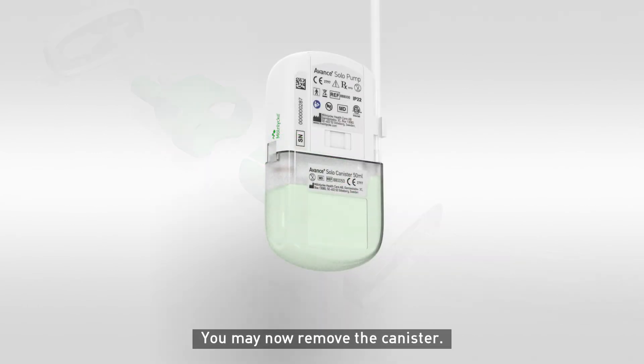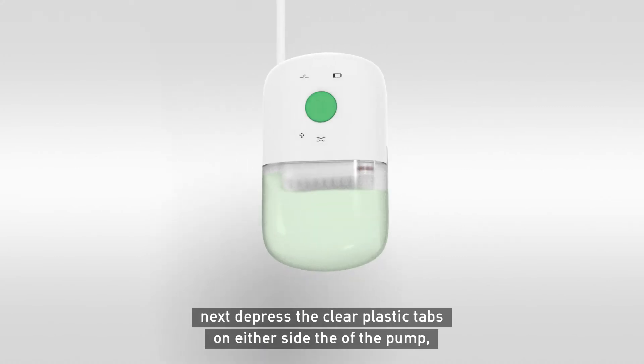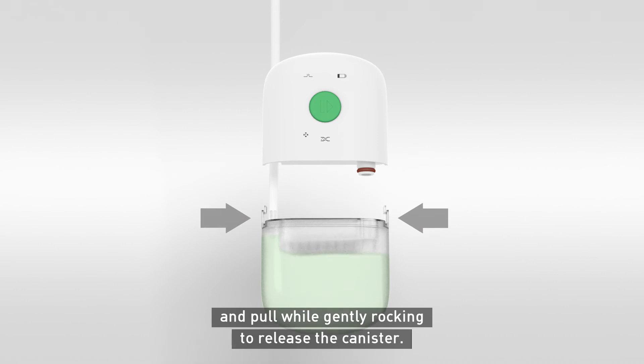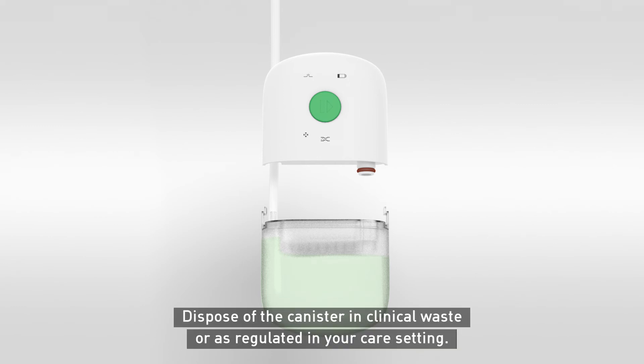You may now remove the canister. First, remove the tubing from the pinch clamp. Next, depress the clear plastic tabs on either side of the pump and pull while gently rocking to release the canister. Once the tabs clear the pump housing, the canister will disengage. Dispose of the canister in clinical waste or as regulated in your care setting.